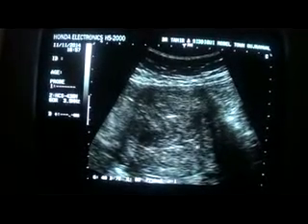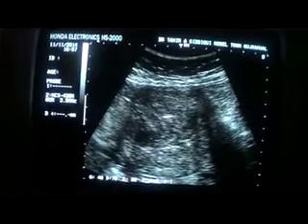So this is a case of uterine fibroid with mass effect on the endometrium. This is the endometrium, this is the endometrial canal, and it is being pushed posteriorly by this solid echogenic mass — fibroid relating to the anterior wall of the uterus. Thank you very much.